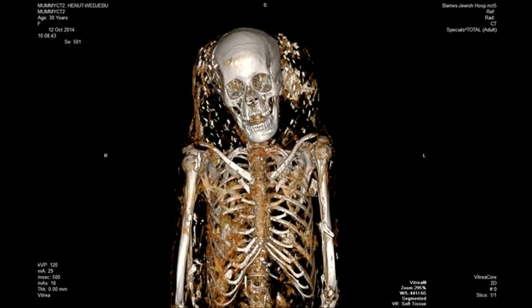So this actually isn't the first piece of quote unquote art that you've scanned, is it? Where you've scanned other artistic things before? Yeah, we actually had the pleasure. My colleague Costa Raptis and I, a few years ago, got contacted by the museum to do a scan of a Western African statue where the question was whether it had been in any way refurbished or if it was intact. And that's where we got a chance to experiment with using CT scans with different energies. And using the different energies, we were able to show that it had different materials. It was pretty interesting.